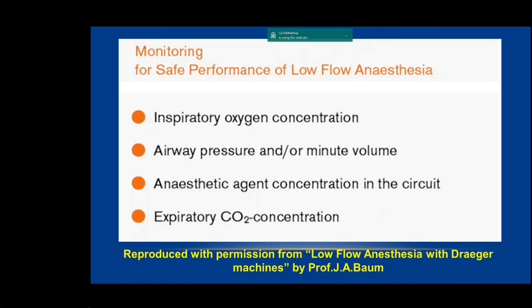So what is the monitoring for safe performance of low flow anesthesia? What is essential? One thing is sure, I'll always say this: if you don't have this infrastructure in your operation theater or in your anesthesia machine, please don't do low flow anesthesia. Always be safe. If you don't have adequate infrastructure, please don't do low flow anesthesia. And what do I mean by infrastructure?